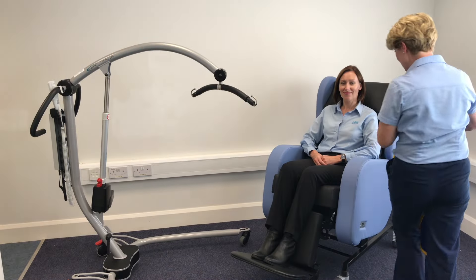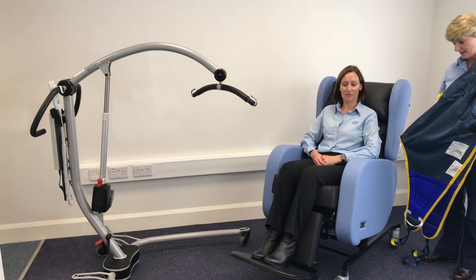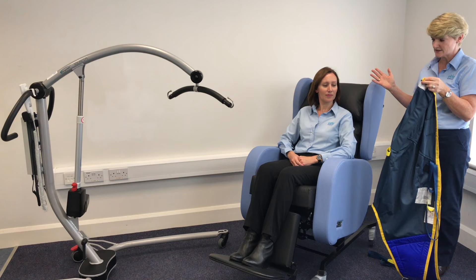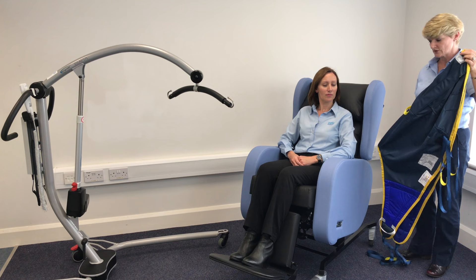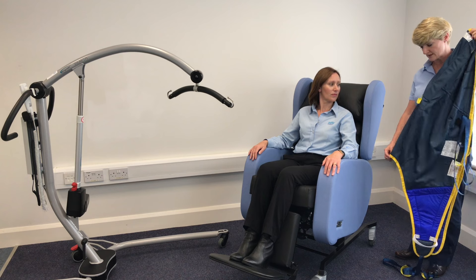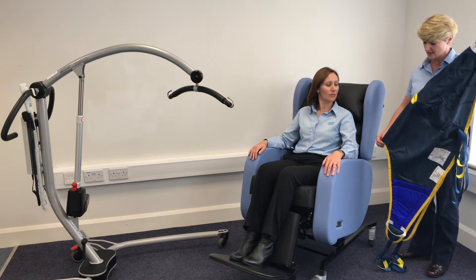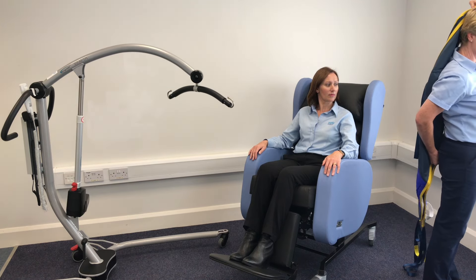This is Deirdre, and I'm going to lift her. The size of sling is very important. If the sling is too big for the patient or the client, there's too much room within it for the client to move and end up twisted and in a bad position. So it is important to have the correct sizing. With the standard padded sling with head support, the best way of judging is actually the height of the patient or client first, not their actual weight. The bottom trim will start at the end of the spine or the end of the coccyx, and the top will finish at the top of the head. That is your very first rule of thumb when sizing a sling.